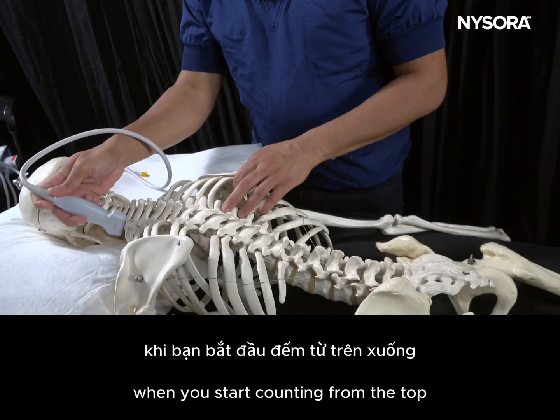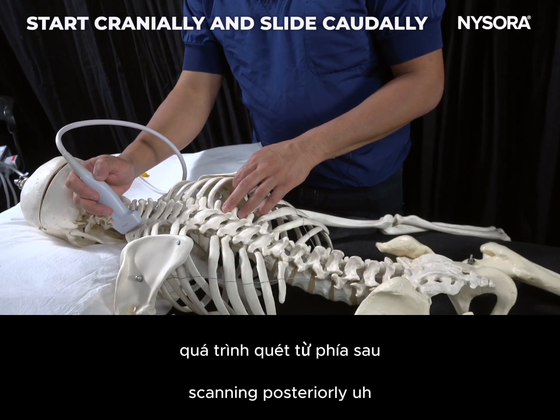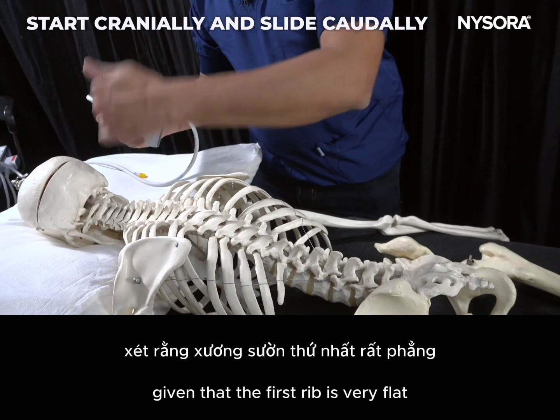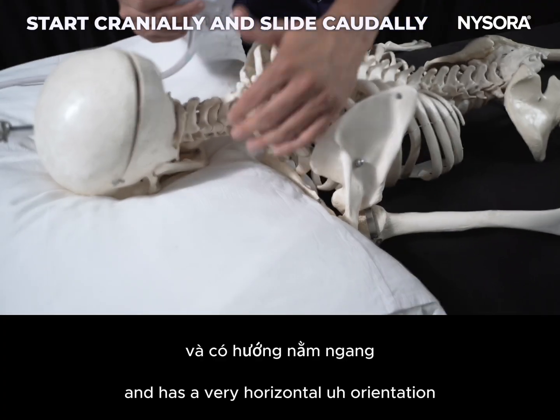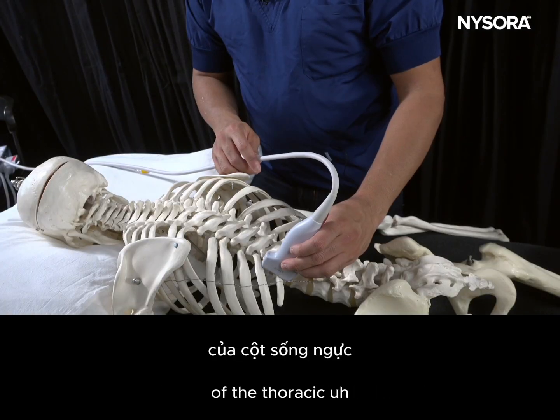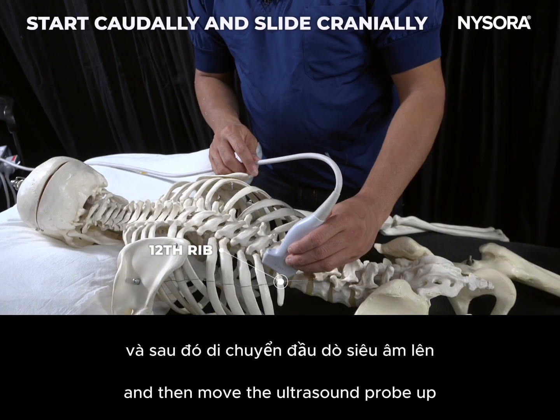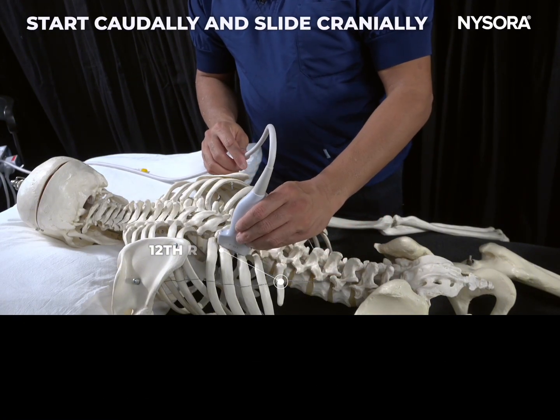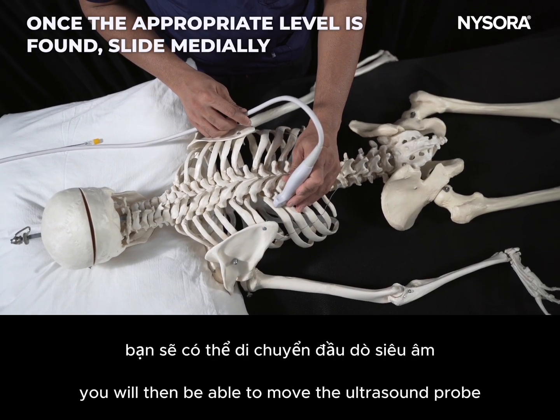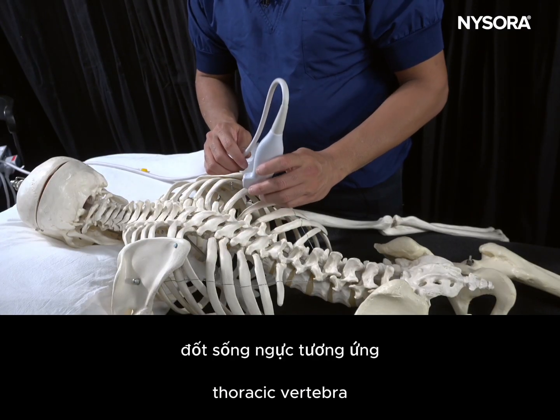When you start counting from the top, the first structure that you'll be able to see on the scanning posteriorly will be the second rib, given that the first rib is very flat and has a very horizontal orientation. The other way to calculate the thoracic levels would be to start at the 12th rib and then move the ultrasound probe up. And once you are at a level of concern to you, you will then be able to move the ultrasound probe medially, and that will take you to the corresponding thoracic vertebra.